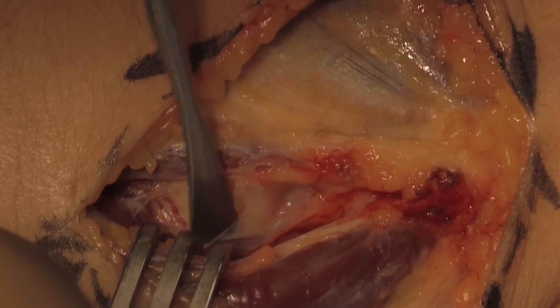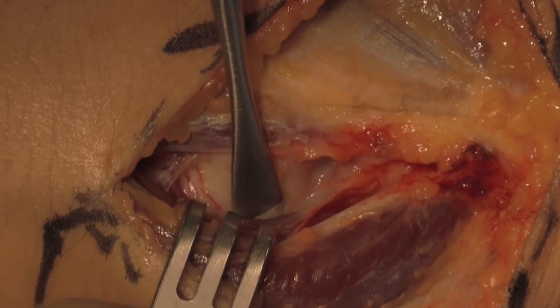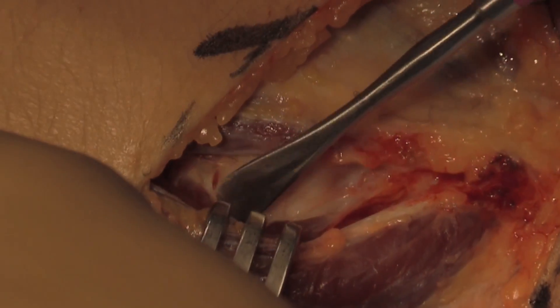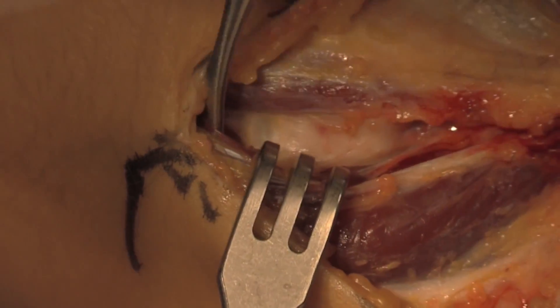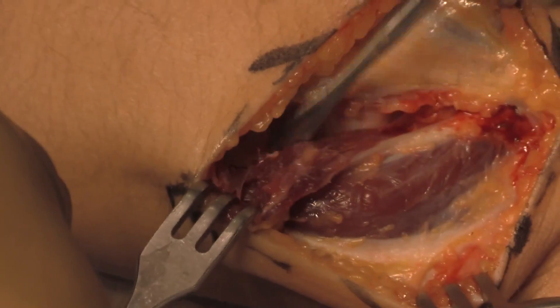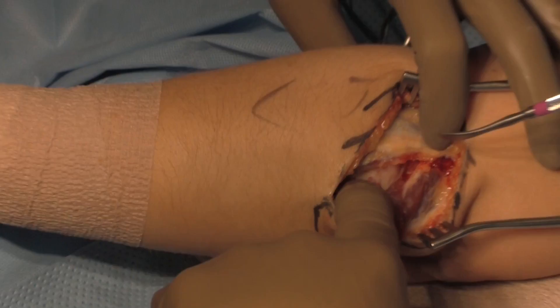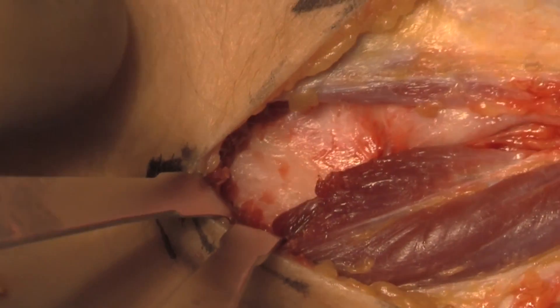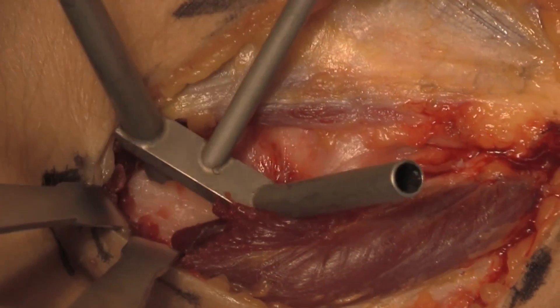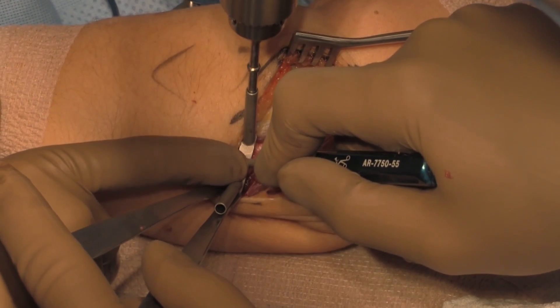Dissection proximally up to the lateral epicondyle and dissection down to the supinator cristae was performed on the ulna. Here we are at the level of the radial head, dissecting free the muscle and fascia to expose the capsule. The capsule plays a critical role as we use it to imbricate later on as part of the reconstruction.